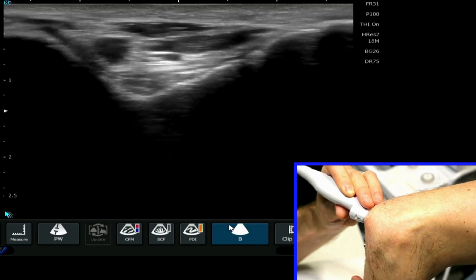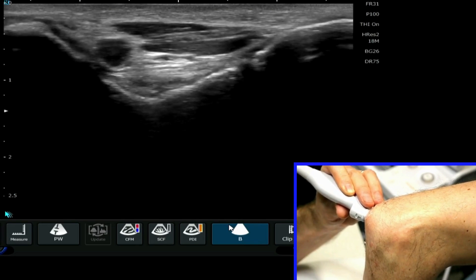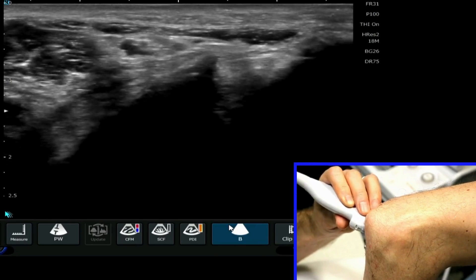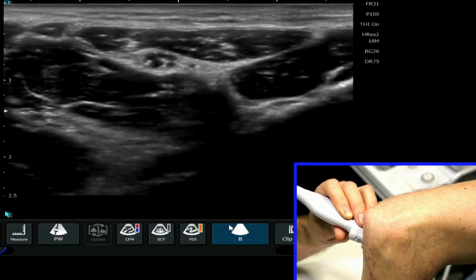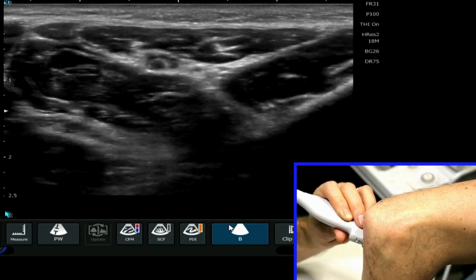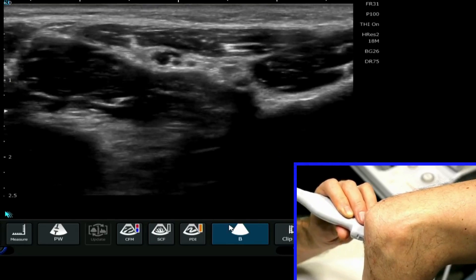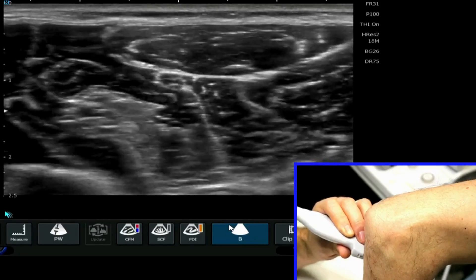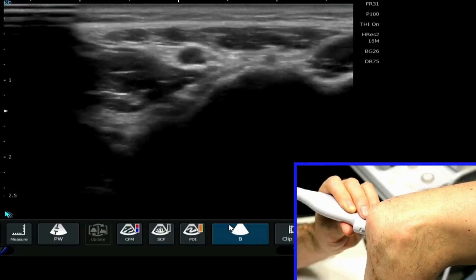Sometimes the ulnar nerve can be quite difficult to identify because there's a lot of anatomy and structures in this area. Coming down, what was initially a hypoechoic-looking structure, we can see now starts to appear with a typical pepper pot appearance and a lot more hyperechoic areas around it. We know that's our ulnar nerve, and we can identify it specifically because it's positioned next to the flexor carpi ulnaris muscle.